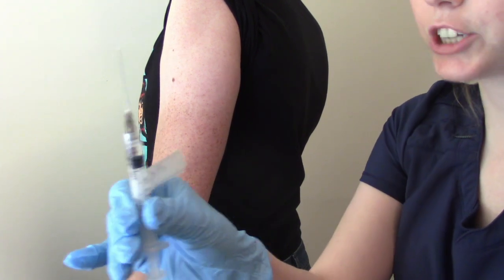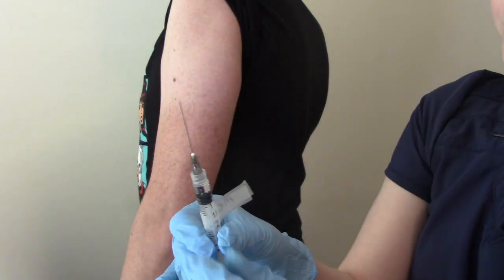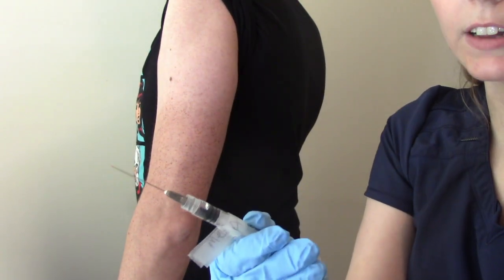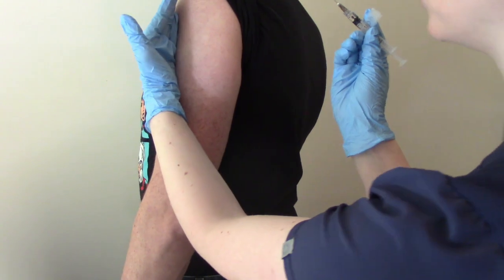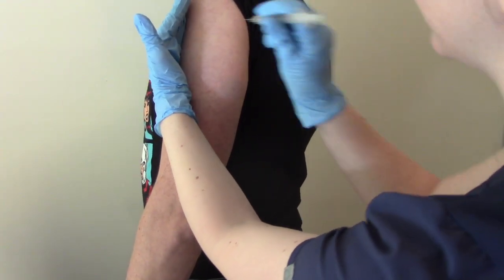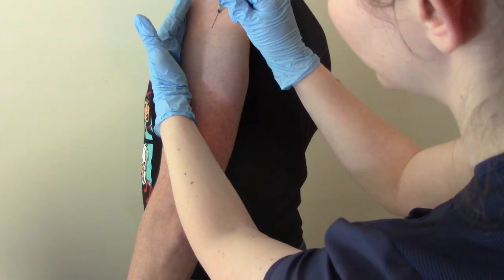So this is our IM injection that's been labeled medication A. We're going to give it bevel up. Use your hand to move it off to the side, and then at a 90 degree angle, you can inject.